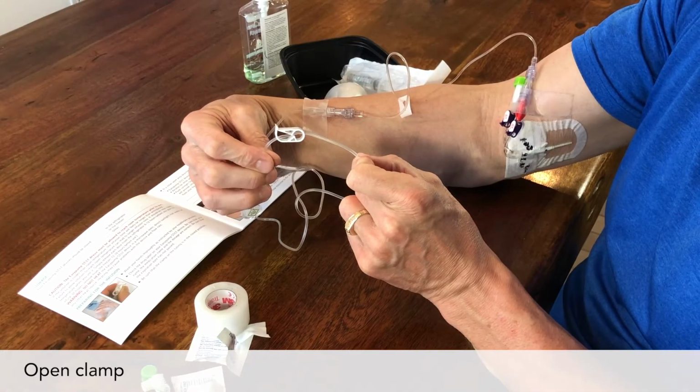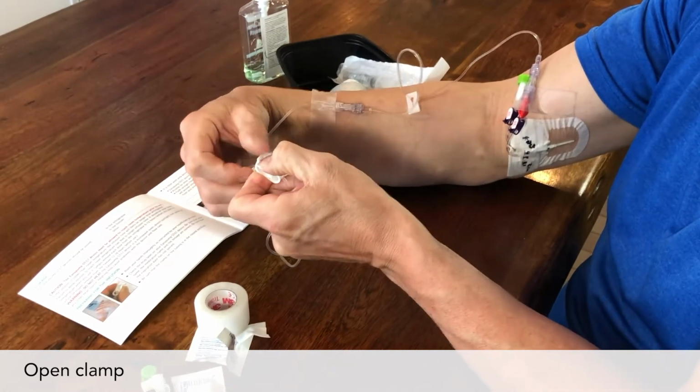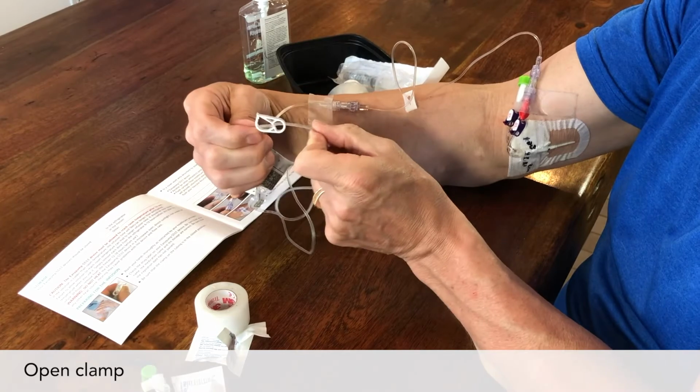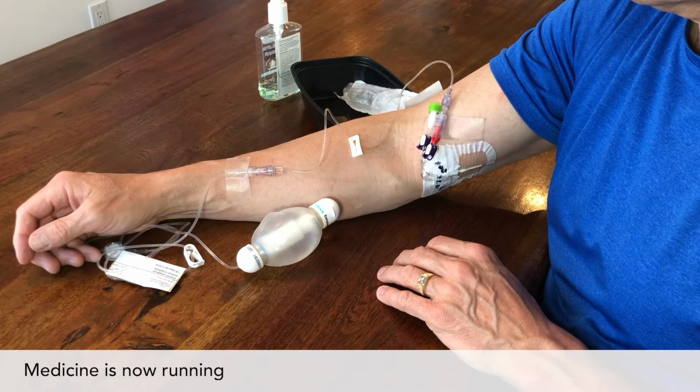Open the clamp on the end of the tubing so the medicine can flow. To open it, you push this white tab backwards. The medicine is now running. Do not squeeze the pump. The medicine will flow by itself.